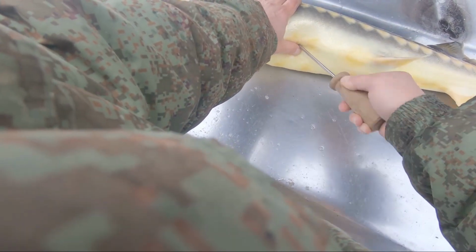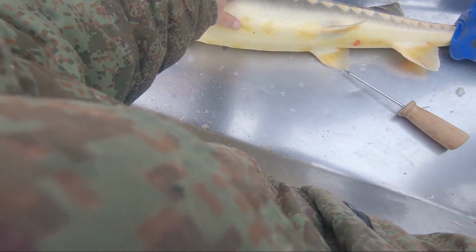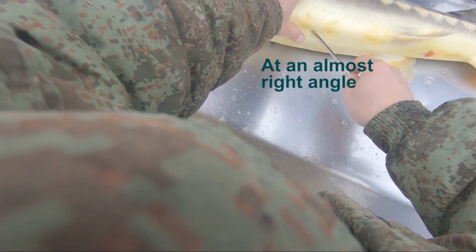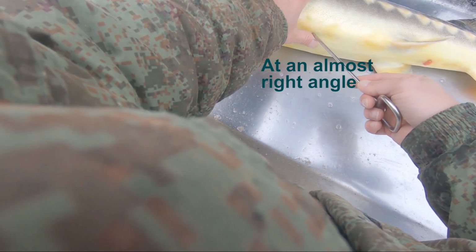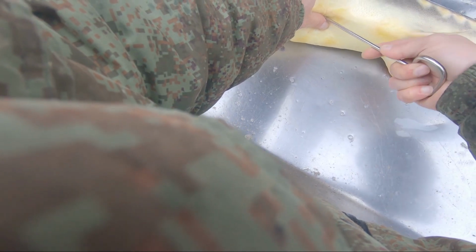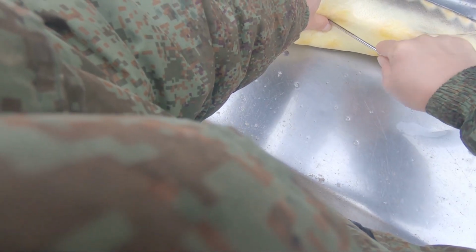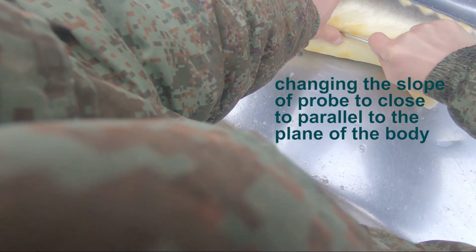Usually the biopsy procedure takes no more than 1.5 to 2 minutes per fish, less if you have experience. Therefore, anesthesia is usually not required. At the same time, if the biopsy is carried out for the first time or work with large fish, more than 20 kilograms, is supposed, you can use anesthetics such as clove oil, benzocaine, lidocaine, and others.